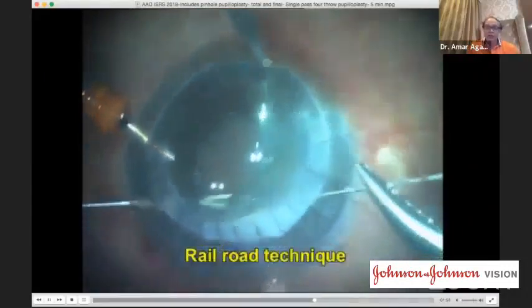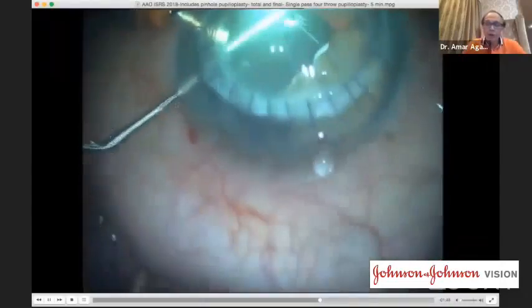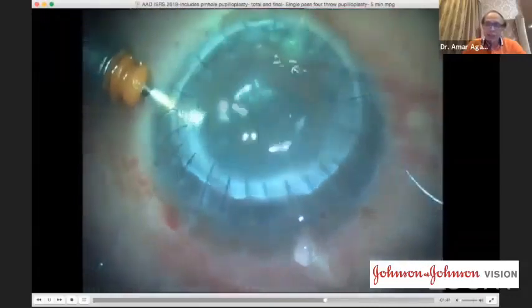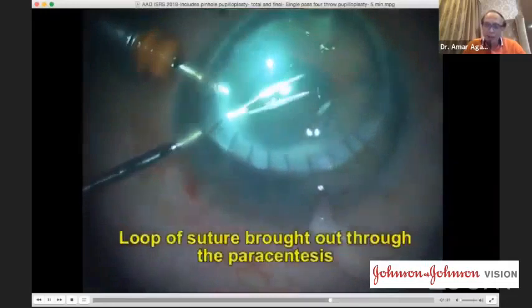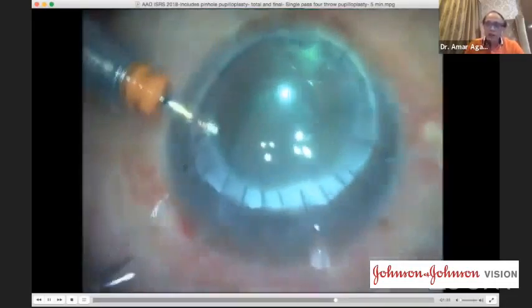So I've got fluid in the eye. This is a trocar AC maintainer. So in this, I've got fluid passing always through the eye. The reason, again, I tell you fluid is, these synechiae will be there. When you break the synechiae, bleeding will happen. If you play with viscoelastic, you can always put viscoelastic in the middle anytime you want. But the fluid washes away the hyphema.